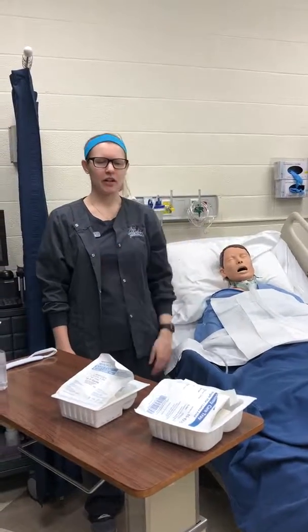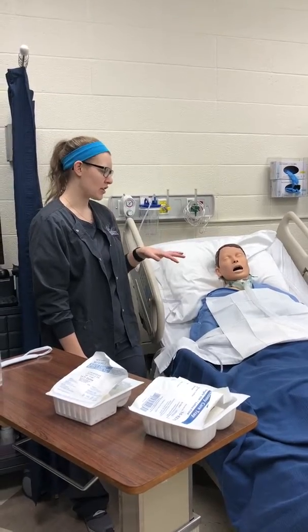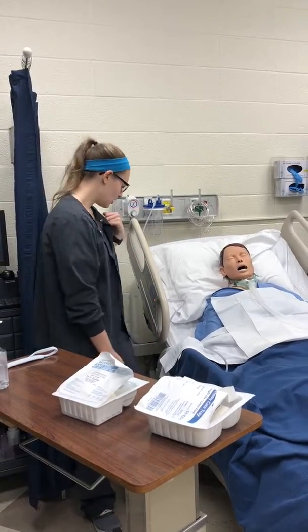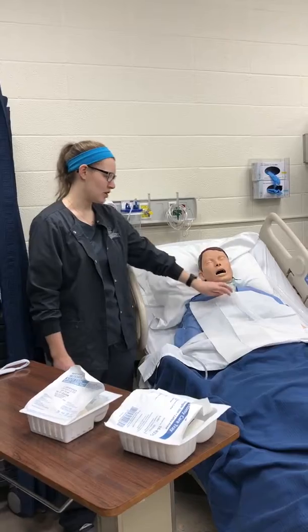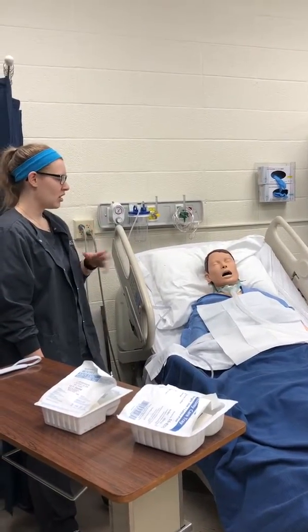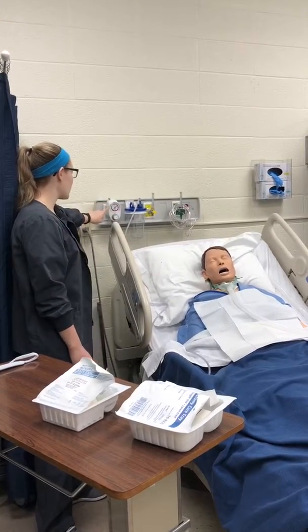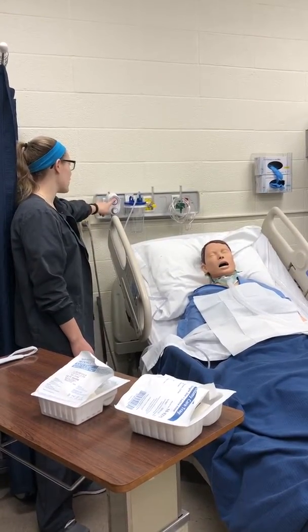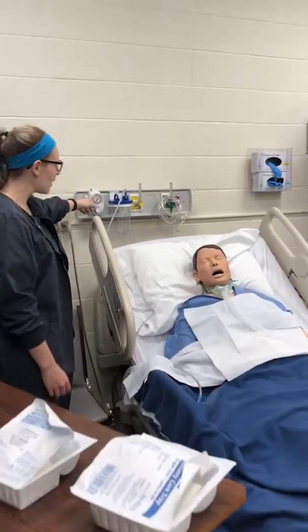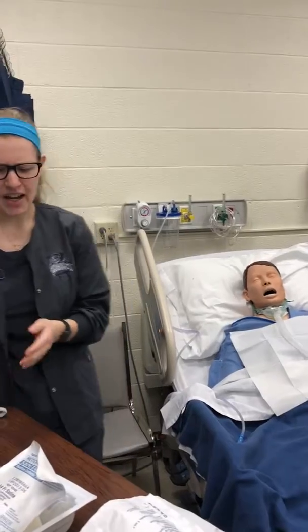It's January 23rd, 2019, and today I'm going to be suctioning a trach and doing a dressing change. So the first thing I want to do is make sure that my patient's being hyperoxygenated because we're going to remove the oxygen to suction. For suctioning purposes, you want your suction to be turned on between 80 and 120 millimeters of mercury. Mine's turned on. I've done hand hygiene.